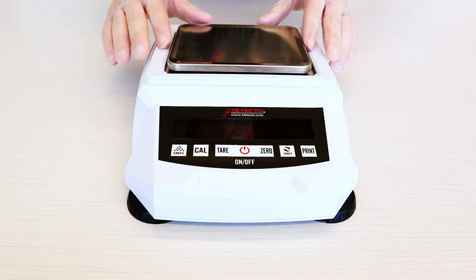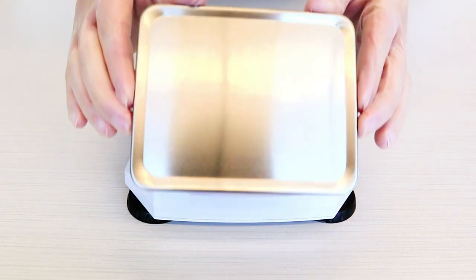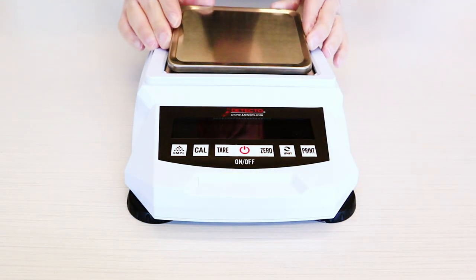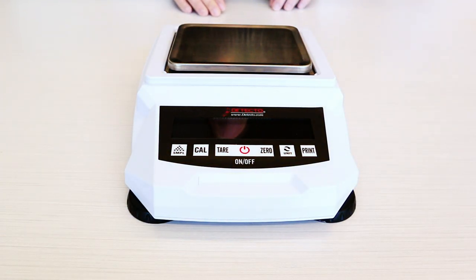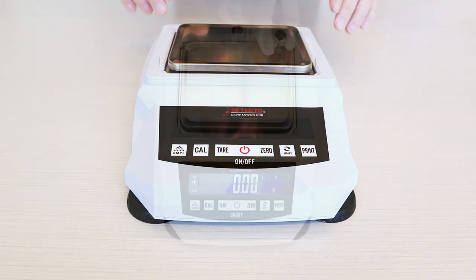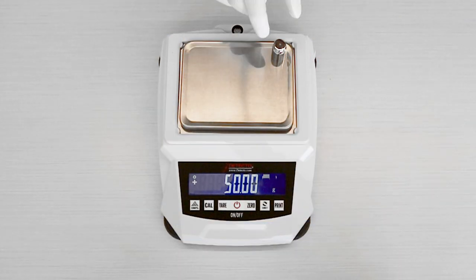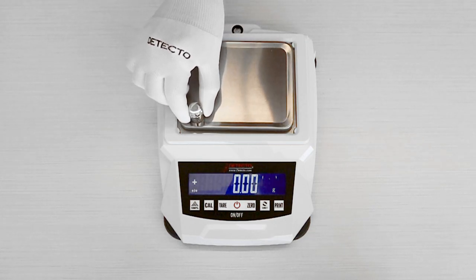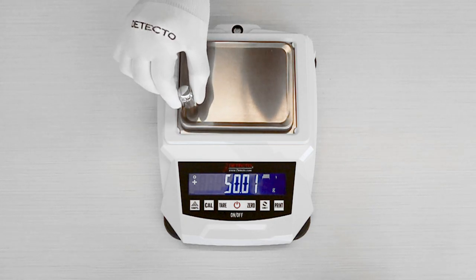All models come with a 5.7 x 4.5 inch stainless steel liftoff platform, except for the model 423000, which has a 7.4 x 5.8 inch larger size platform. You can see the 420 series quality by placing a weight in all four corners — it weighs accurately and consistently in each location.